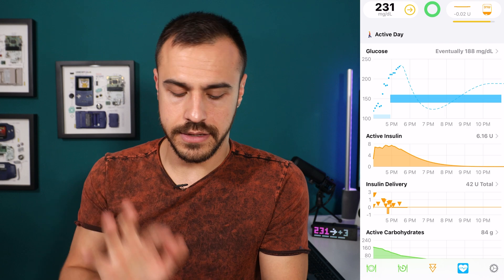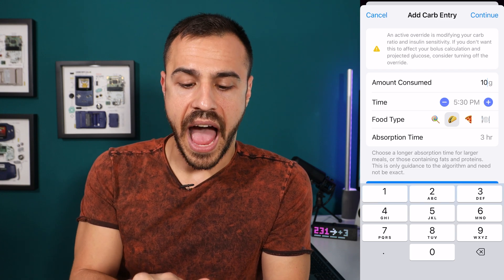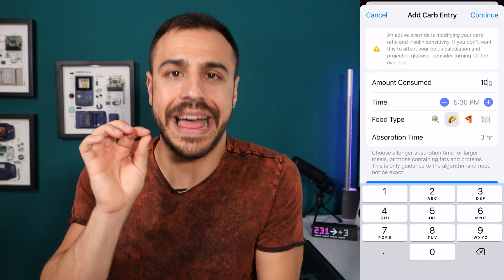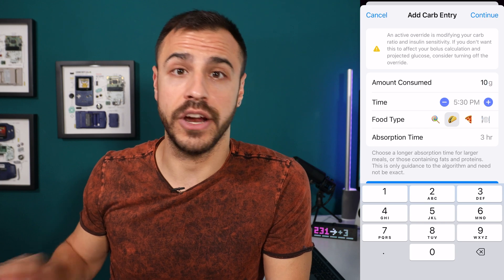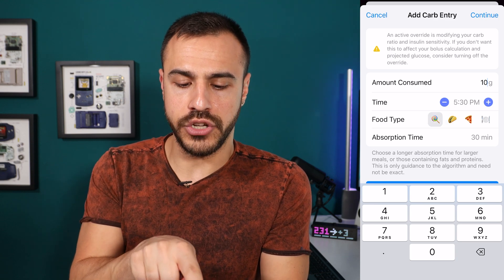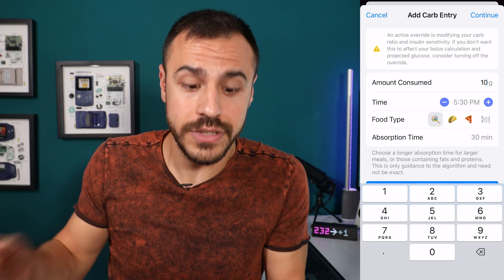Along the bottom there are a few icons. The first one is the fork, knife, and plate. When I tap into that, this is where I can log carbs. Let's say I'm going to have 10 grams of carbs — I can choose the time, let's say in 20 minutes. Then I can choose the food type. This is where glycemic index comes into play, and this is one of the most incredible things that Loop has that other systems do not. The three main ones shown are: the lollipop with absorption time of 30 minutes, because candies and many fast-absorbing foods hit your bloodstream in 30 minutes — think orange juice.